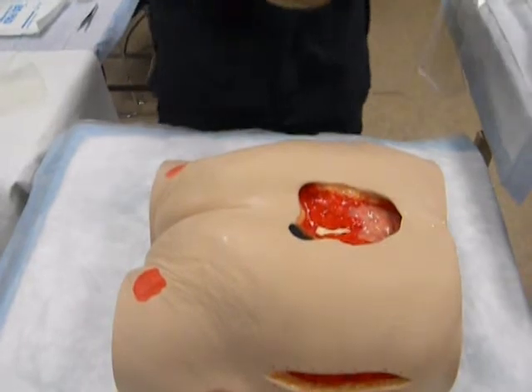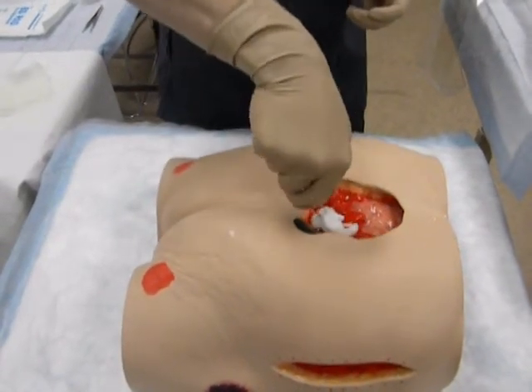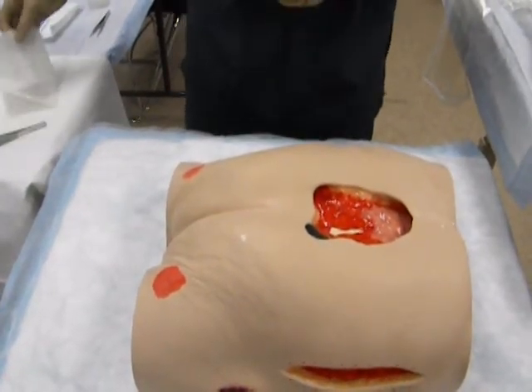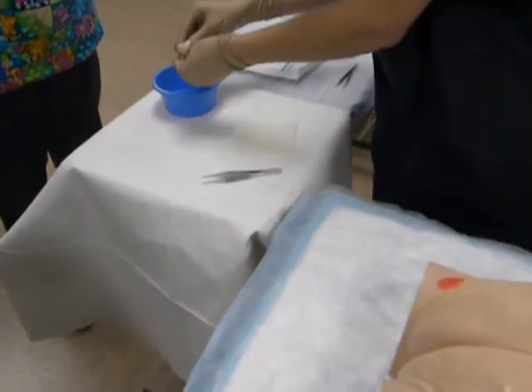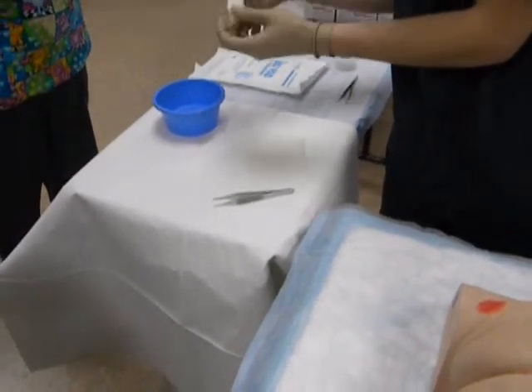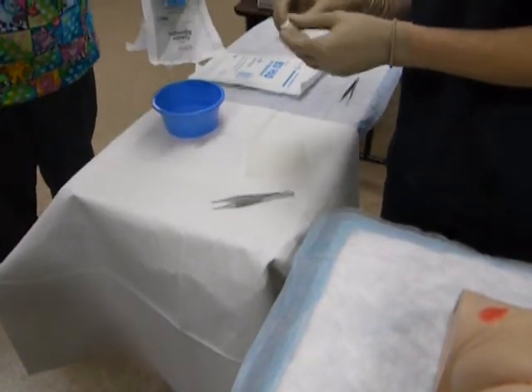then we will begin to lay our clean bed of dressing. The packing material that is chosen is per doctor order, depending on size and stage of the pressure ulcer. Choices being sterile gauze 2x2, 4x4.